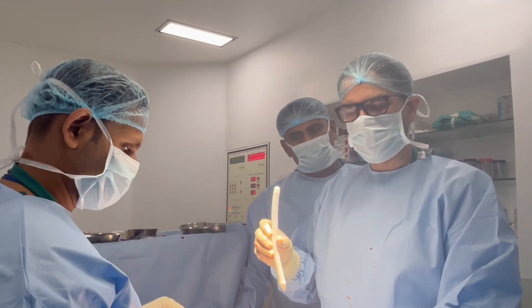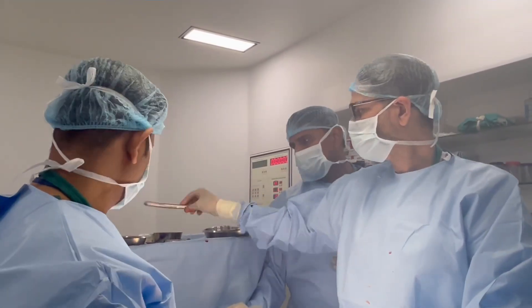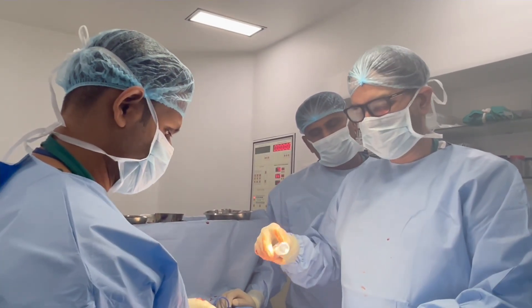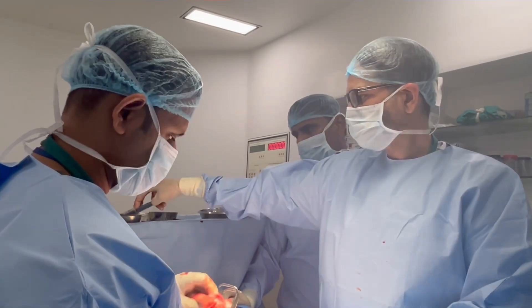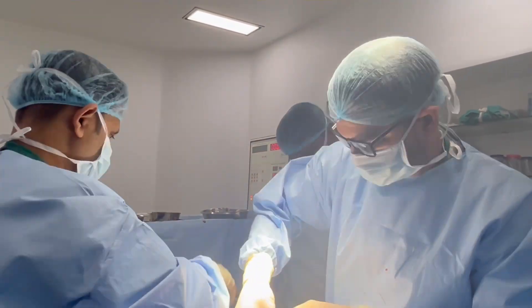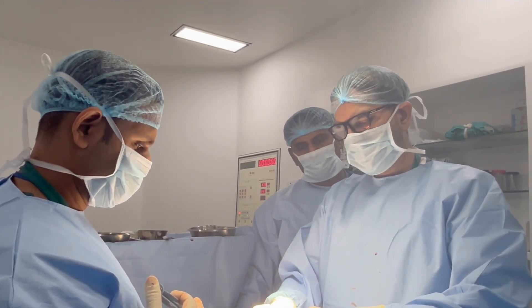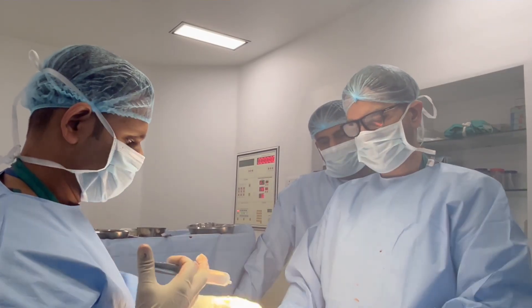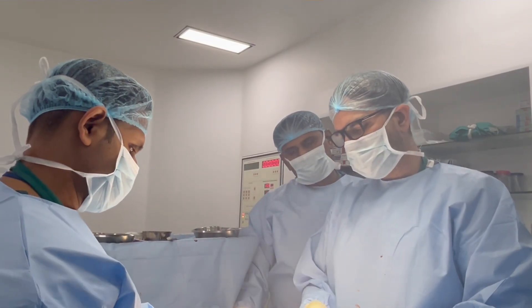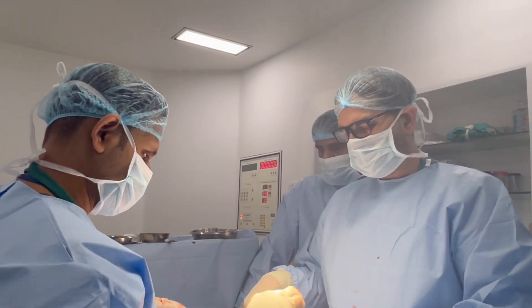Now we place the implants. We put this implant in one side and then the other side. Now we have both implants placed in both corpora. The implants are well placed — both implants are felt at mid-glans. It's a good fit, not too tight, no oversizing. We give antibiotic wash at every step so that the wound will have antibiotic coating and there will be no infection.